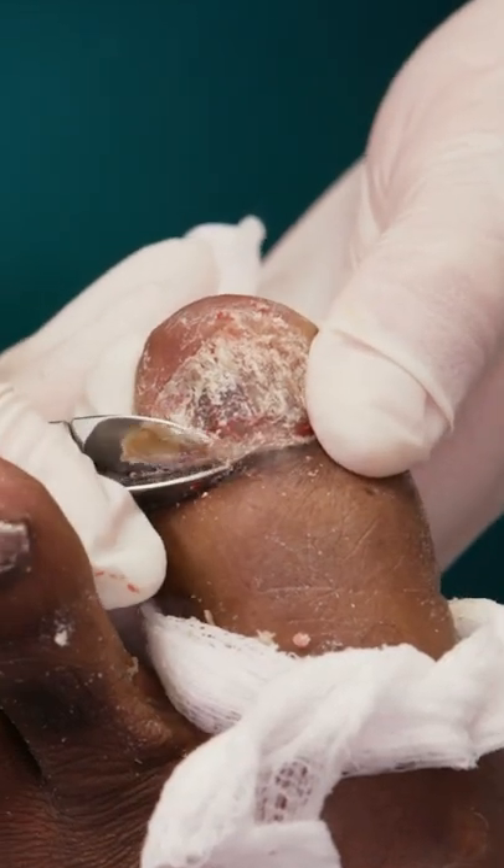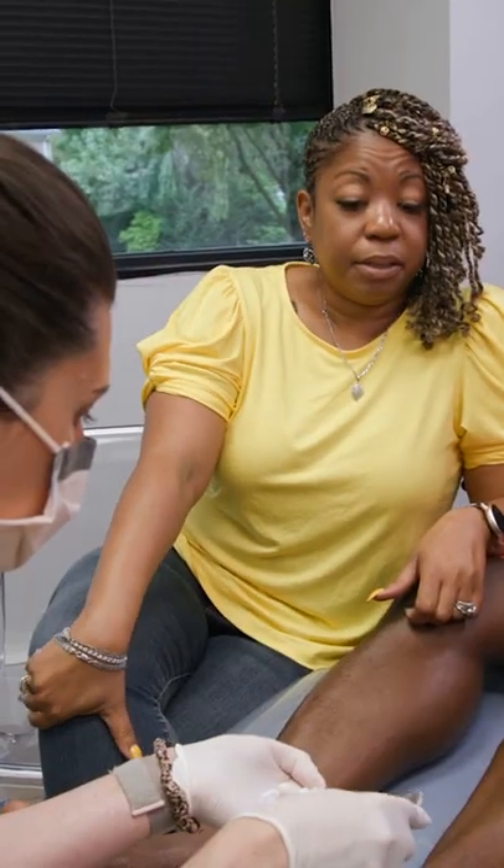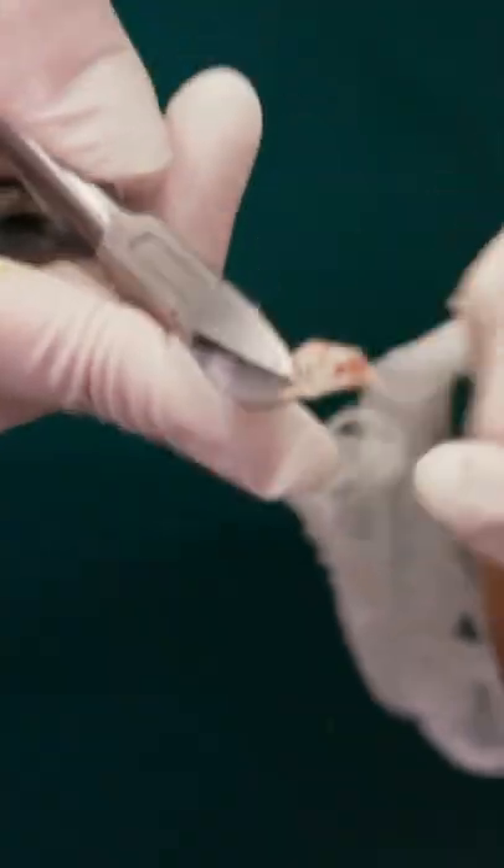There's the plate — that's coming off as a unit. Look at that, pretty crazy, right? I finally got that toenail off, and I'm really hoping the next one's a lot easier.